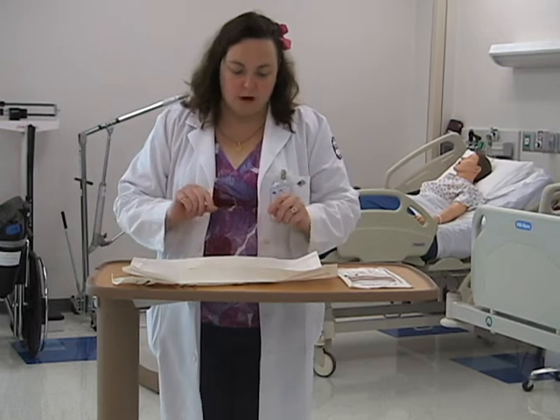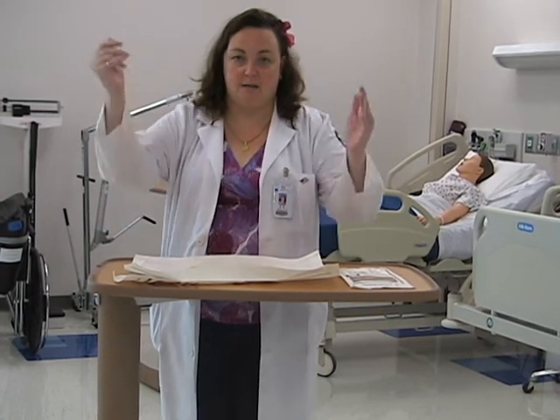One of the biggest problems people have with doing sterile gloving is the fear of contaminating something. What I want you to do as students is practice. You can get sterile gloves and practice. Once you get this technique down, it will lessen your anxiety when you go on to do further procedures.